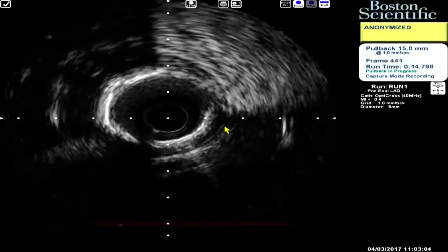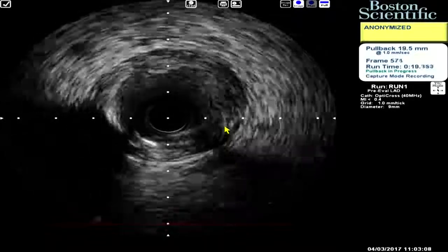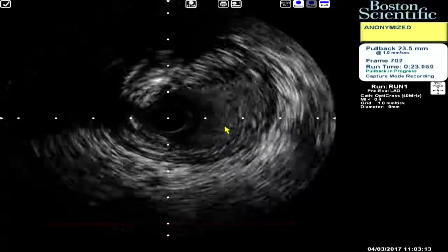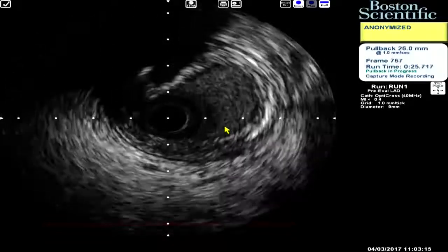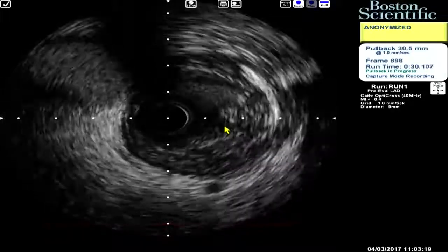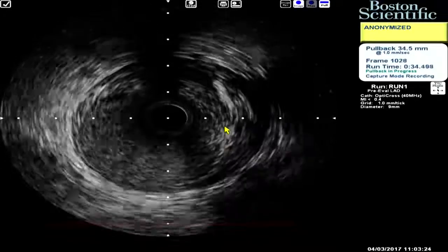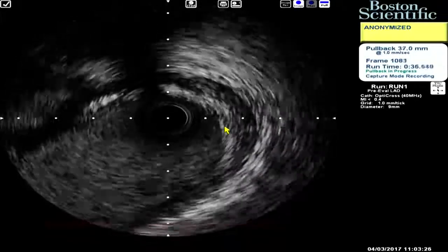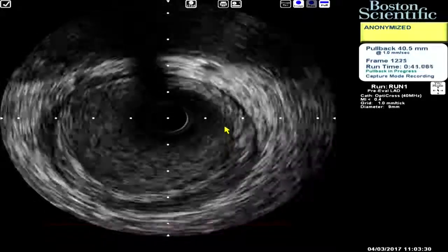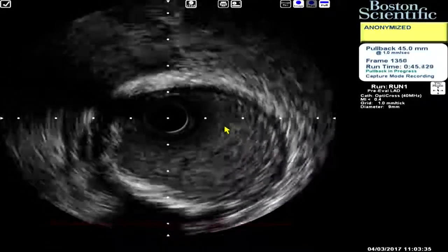So there, that's calcium, Mathew. Distally, that's a circumferential calcium. Circumferential calcification. Yeah, but it's patchy. Now there is no calcium. Now again, calcium is appearing on the 1 o'clock to 5 o'clock position. No calcium again, fibrotic plaque. Yeah, this looks... no calcium, not badly diseased.